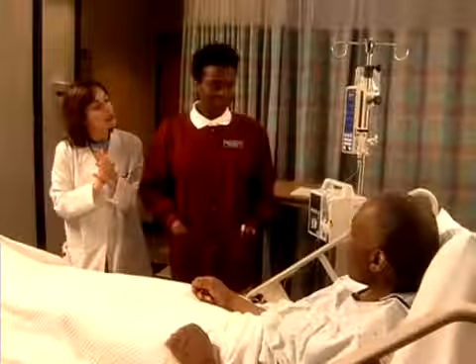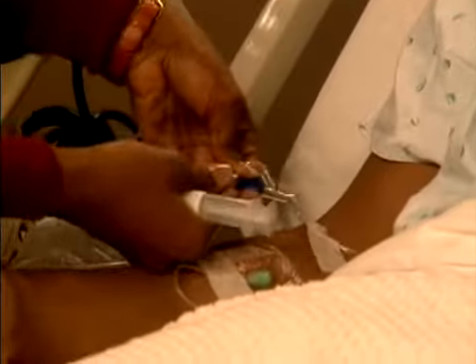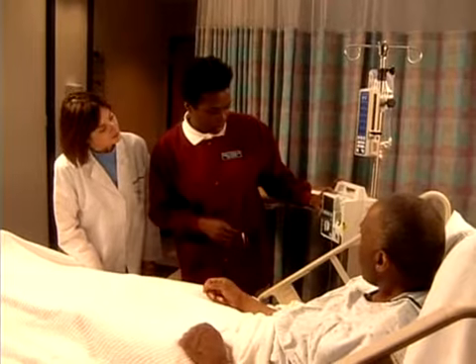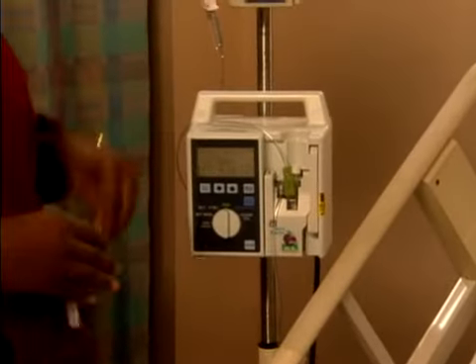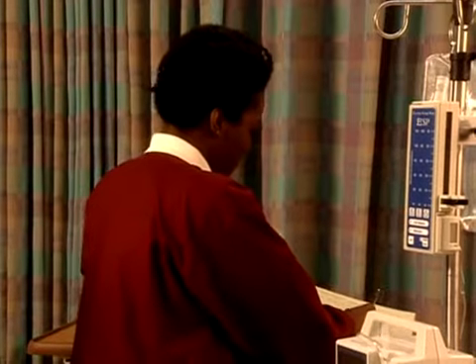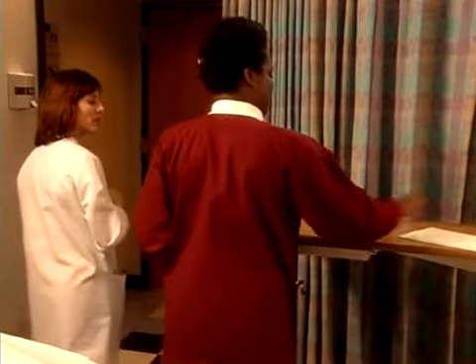Now that the infusion is complete, you can press the off button on the pump, disconnect, and properly discard the tubing. Okay. Next, I'll recheck the primary infusion and document the medication administration. Very good, Tamika. Everything okay, Mr. Nixon? Great. We're all set. I'll check back with you in a bit, okay? Thank you. Let me grab that and we'll take that with us and discard.